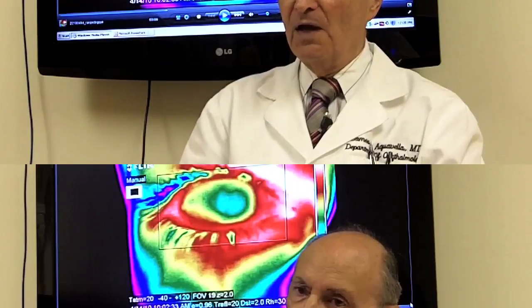We have deployed specific, unique technology in this chamber, which no one else in the world has, which enables us to determine and to study variations in the tear film that fluctuates on the surface of the eye. The tear breakup will, of course, affect the visual acuity, and we can translate that into a reading, not that I see blurry or I see well, but we can translate that into 20/40, 20/25, 20/70, or 20/60. And we can get that reading many times during the course of a second.